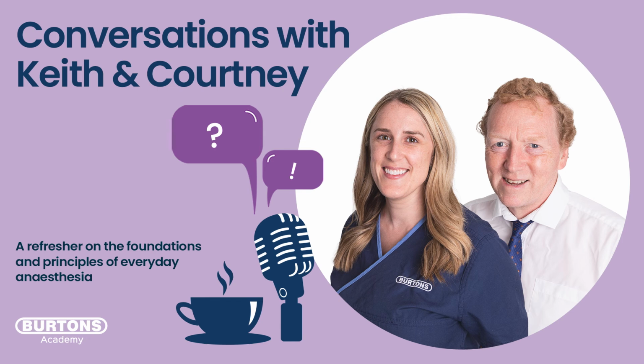But just to give you and our listeners an idea that capnography is an incredibly powerful tool, and we can use it at all sorts of levels. We can use it at a very basic level with numbers. You can use it as numbers plus the outline of the capnogram, or we can start to use it in a very, very sophisticated way to look at these dead space values and get a lot of information about the way that the body is behaving. But at the end of the day, what we really want to do is achieve and confirm a status quo within our patient that is just like it was when we anesthetized it, that everything is as it should be. And that's really what we're trying to prove and achieve.